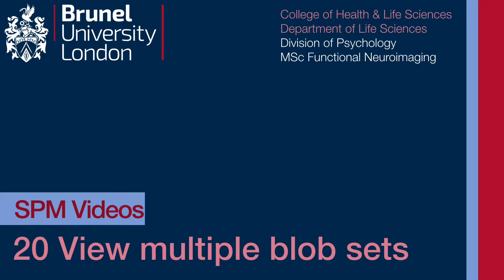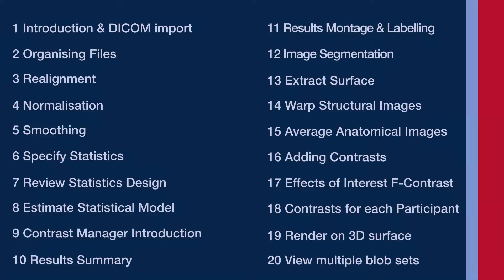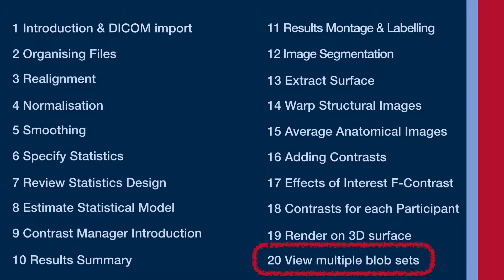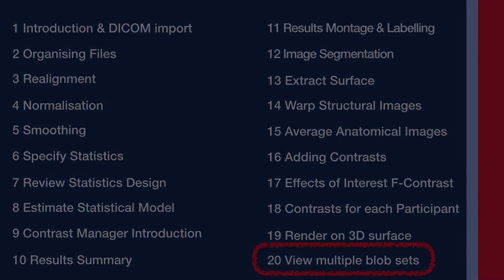Video number 20 is about saving blob sets or statistical parametric maps so you can use them in different kinds of visualization like montages and overlays. It's a great way to investigate multiple contrasts and conditions.